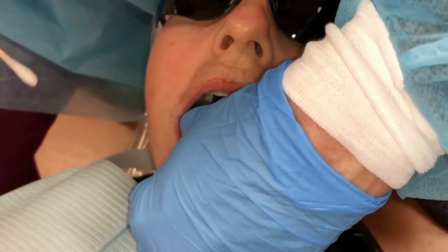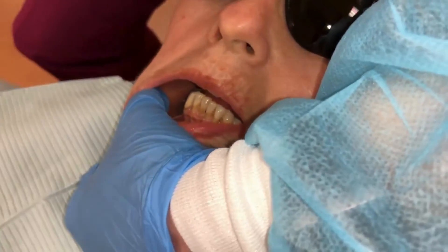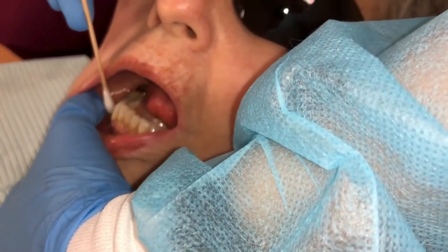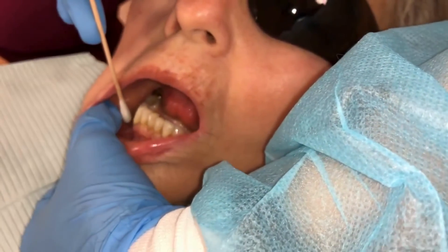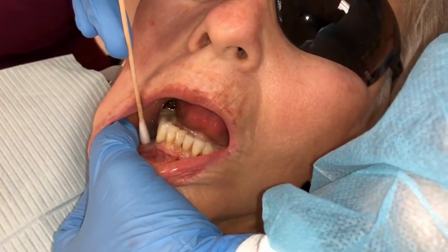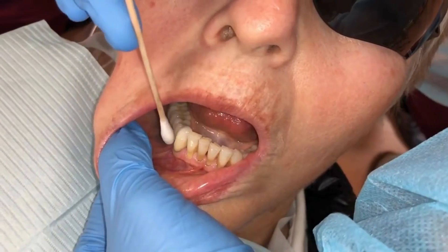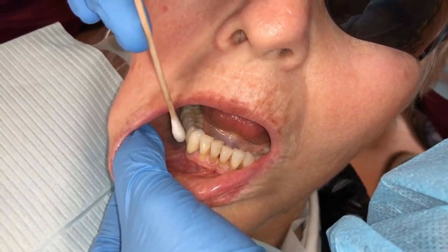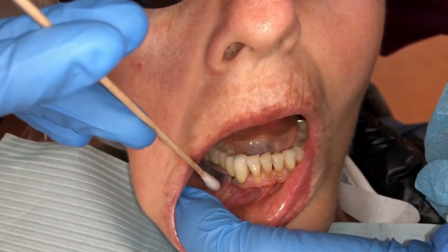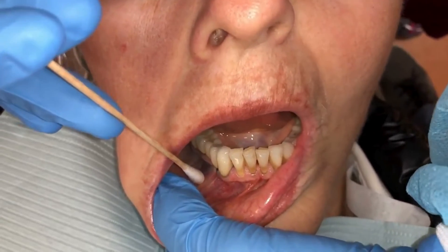The clinician can utilize radiographs and palpation to identify the mental foramen. It is best to retract to be able to visualize the area between the two premolars. The insertion site will be at the depth of the mucobuccal fold, at approximately 20 degrees to the long axis of the root.